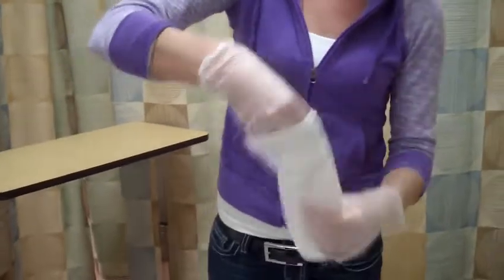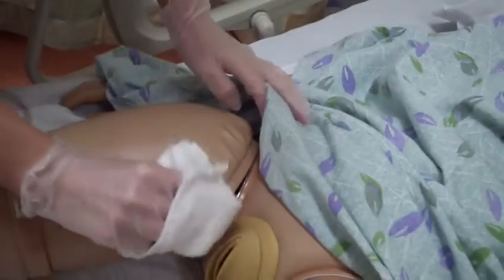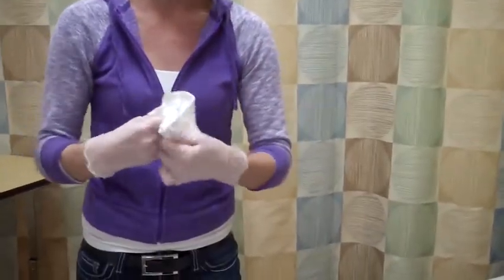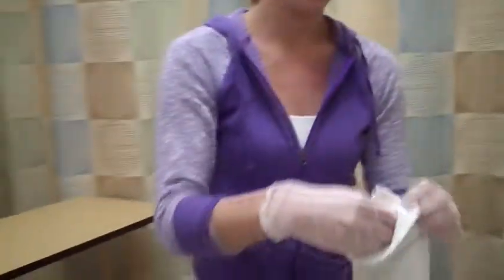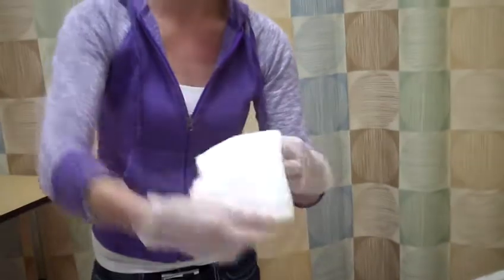Center, pick up, tuck it in like that. We're just going to clean the outside of her labia, always from front to back. Switching sides. Clean that side. And flipping the washcloth around so we have another clean side and clean down her middle.